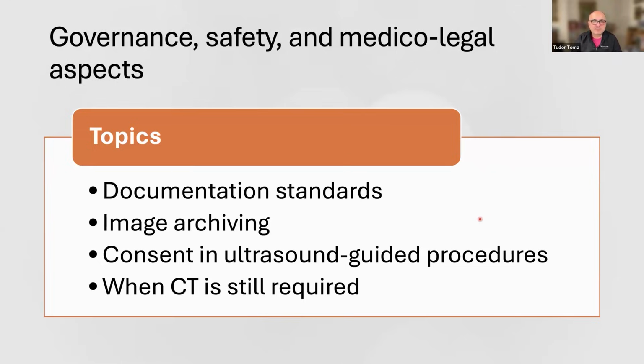I think in a way it's unfortunate because it does really help exchange, but it has its risks as well, and therefore we have a strict protocol for image archiving that's also linked with the consent. So when we do consent for bronchoscopy, we consent for image archiving, image collection.